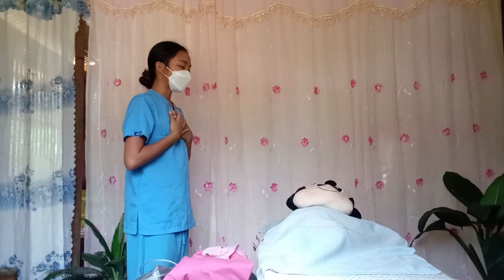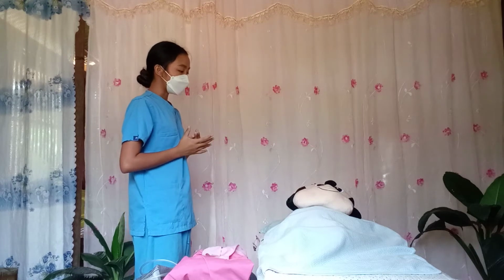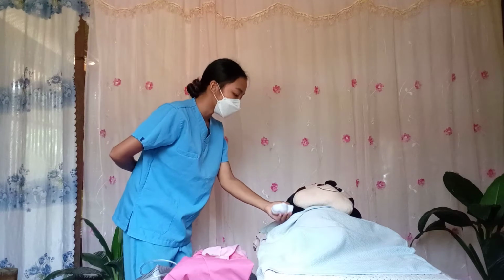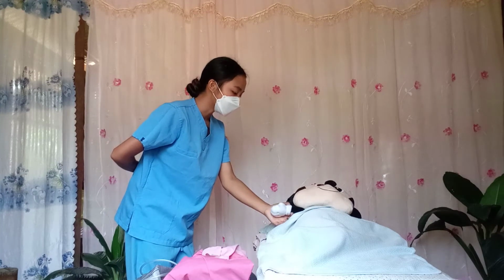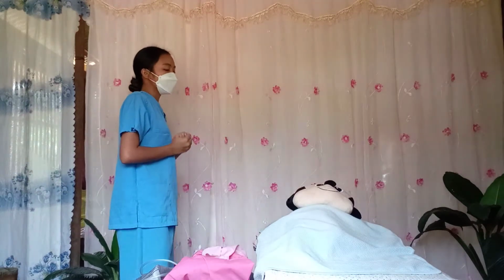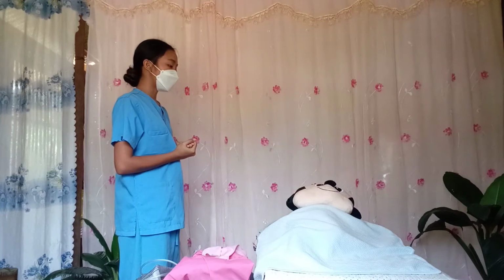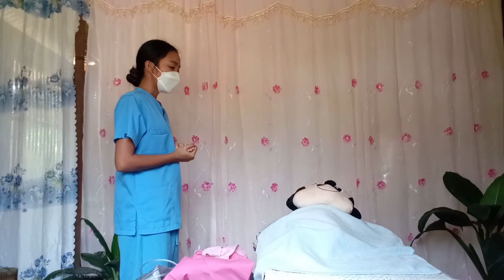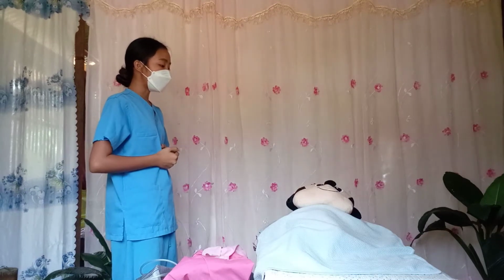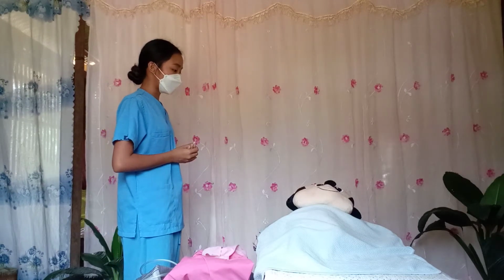Good morning, ma'am. I am Janice alay-ay, your student nurse for today. May I see your wristband, ma'am? Thank you so much. Can you please state your complete name and your birthday? Okay. We understand that you're having difficulty in urinating. That's why Dr. Tom ordered a urinary catheterization for you. In this procedure, I'll be inserting a tube through your urethra into your urinary bladder for you to be able to excrete urine.